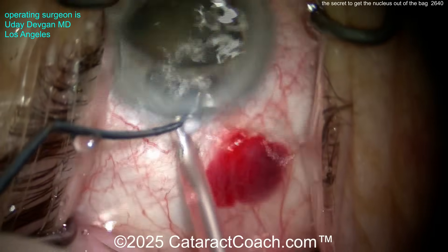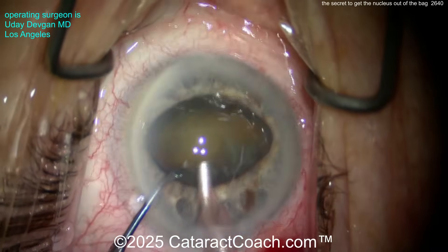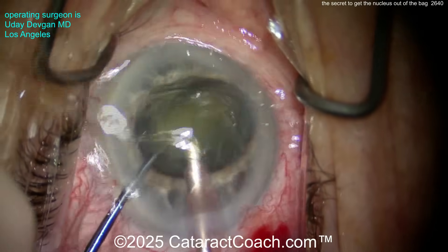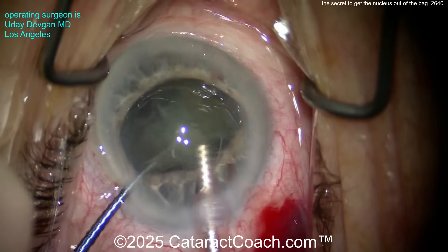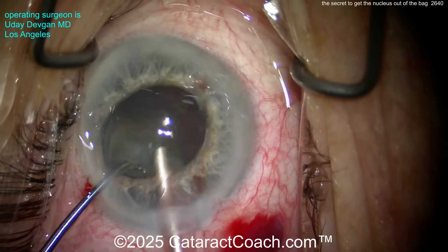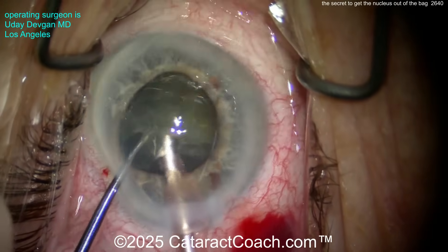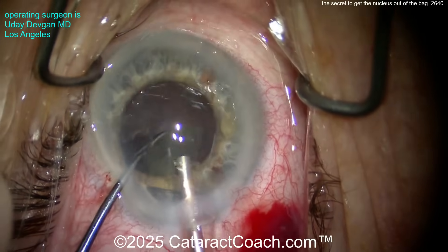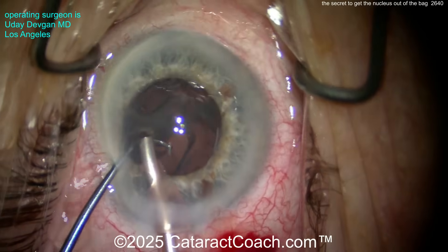So we'll go in here with the phaco probe. There's a little subconjunctival hemorrhage — we know it means nothing, but the patient's definitely going to complain about it. Buzzer to the nucleus right here, chopper goes around — pow, two halves. Easily created those two halves. Now here's the key in doing the phaco: stay in the center. Don't go out towards the pupil margin, because if you nail that floppy iris — this is a blue-eyed patient and that blue iris is very fragile — if you suck it up with the phaco probe, it'll get damaged and cause a pupil defect. Cosmetically and functionally the patient's not going to be happy. So staying in the center and emulsifying the pieces. You can see how quick you get the nucleus down. The chopper stays in that safe position. And look at the iris starting to prolapse through the paracentesis — it's definitely a floppy iris case.